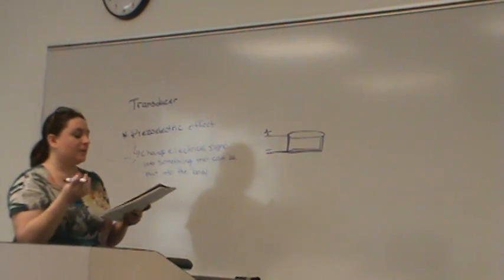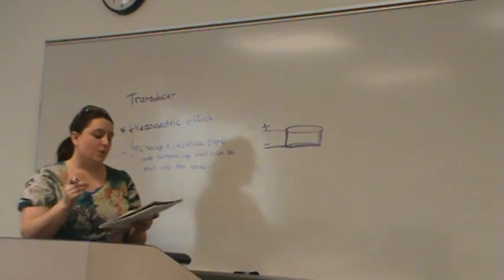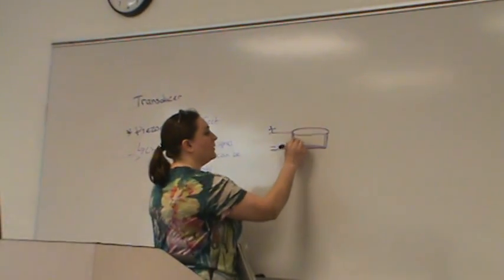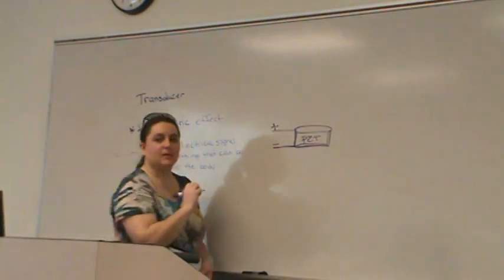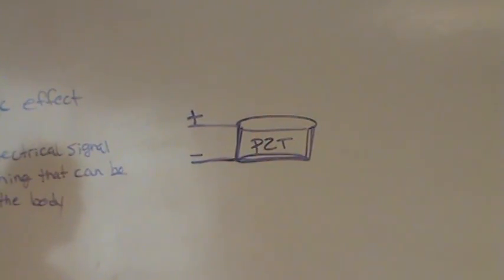So we have, this is just the crystal part. I remember the crystal part has a couple of wires to it. So this crystal, remember it's made out of that stuff called PZT. What does PZT stand for? Remember?